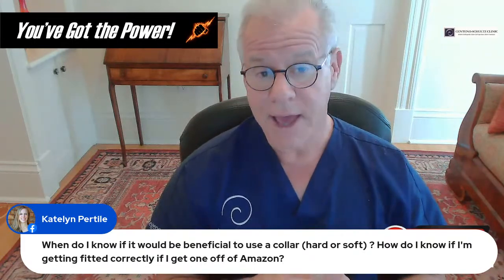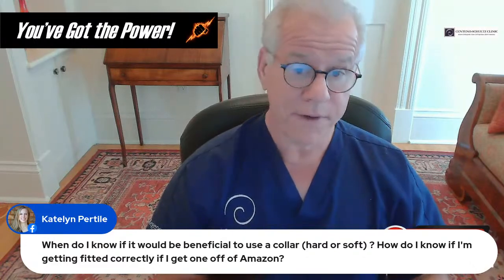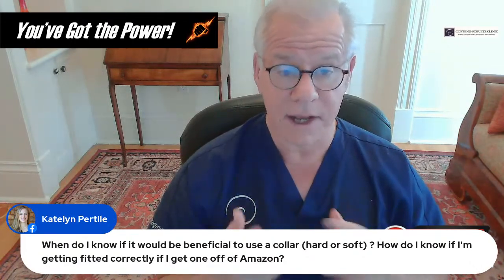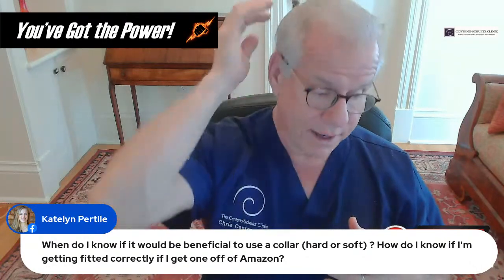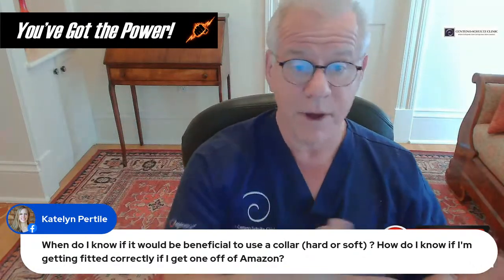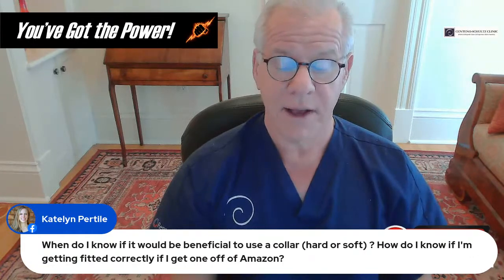What I mean by that is you may start with something like a Miami J collar off of Amazon, and then you may have to cut it down a little bit. I've seen patients that have had to customize them, take a little bit out in the chin area, take a little bit out back here so it doesn't press in the wrong spot. Make sure it's the right size, small, medium, large. Make sure all the adjustments on the Miami J collar are appropriate, etc.